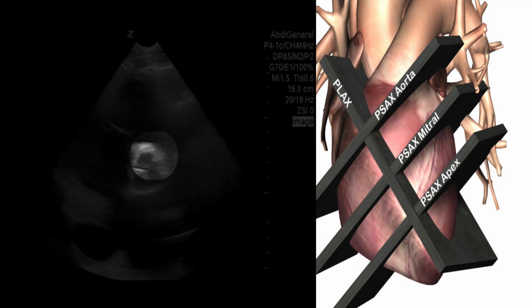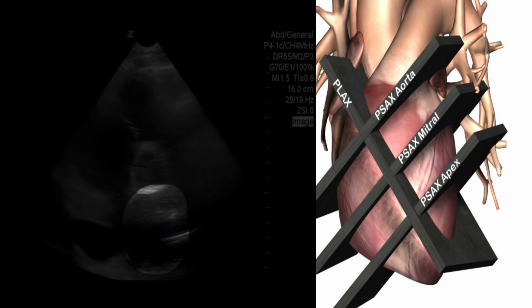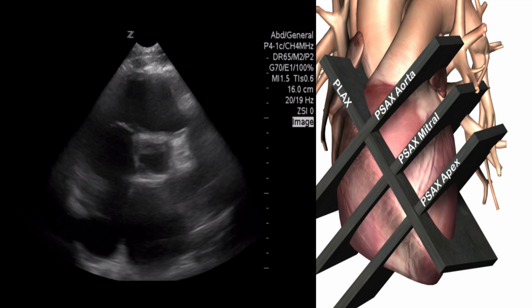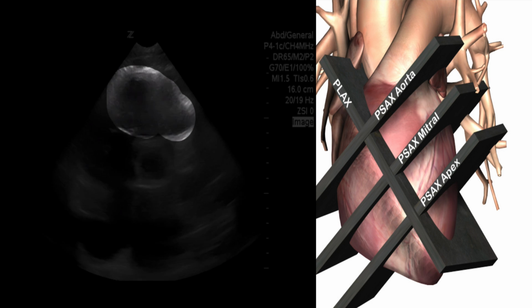In this video, the aortic valve is centered in the middle of the image. It is sometimes referred to as the Mercedes-Benz sign because it's a 3-leaflet valve system. The left atrium is on the bottom part of the screen, or posterior to the aortic valve. The right atrium is just left, and the tricuspid valve is just left of the aortic valve as well. And the right ventricular outflow tract is at the top of the screen.